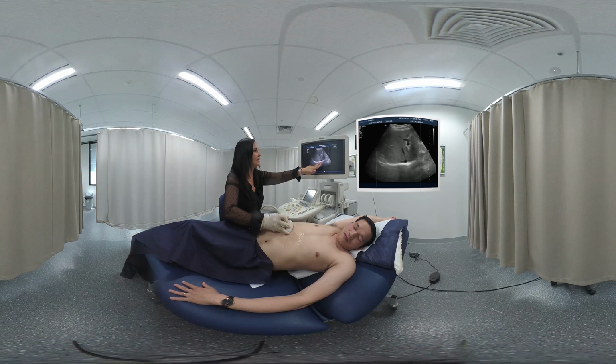This time we're going to have a good look at the hepatic veins. So as you can see there, these three little black slits are called the hepatic veins. Now, when they're occluded, sometimes, in children in particular, there's a disease process known as Budd-Chiari. Now, Budd-Chiari is when there's a thrombus or a membrane occluding the IVC and the drainage of the liver is restricted. So here we're seeing our right hepatic vein, our middle hepatic vein, which separates the right and the left liver, and our left hepatic vein, which comes down, and this is our sunrise sign that we're seeing here.